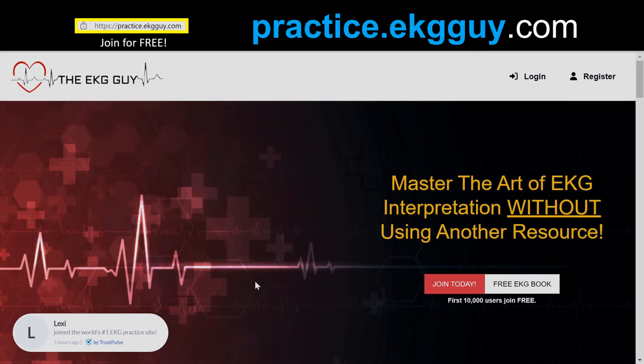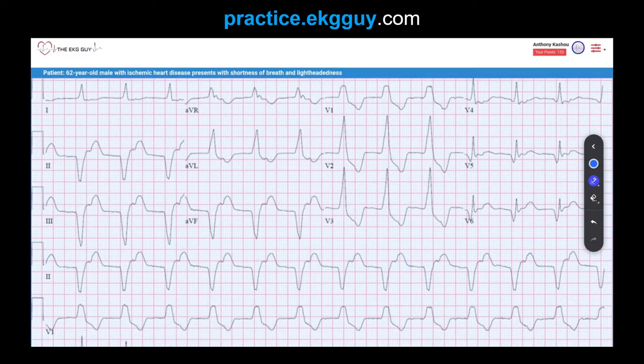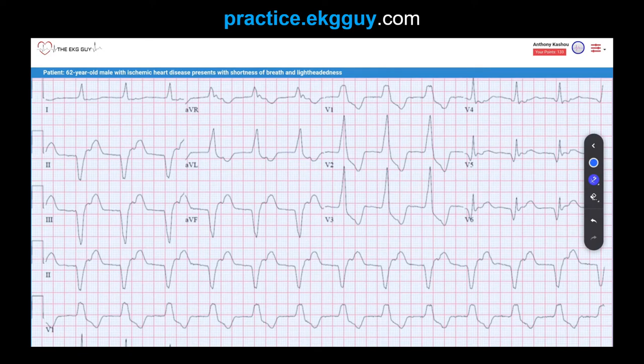Let's go to our question to review. Here we have an ECG obtained from a 62-year-old male with ischemic heart disease. He presents with shortness of breath and lightheadedness. This ECG shows a wide complex regular rhythm at 77 beats per minute, and this is most consistent with accelerated idioventricular rhythm.